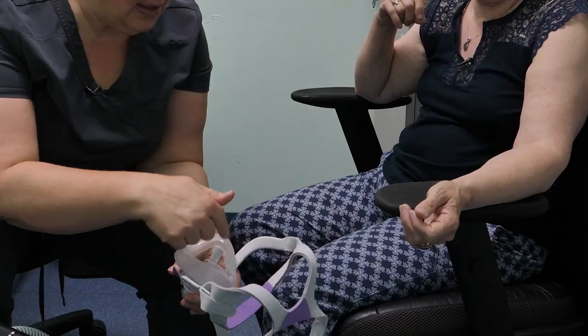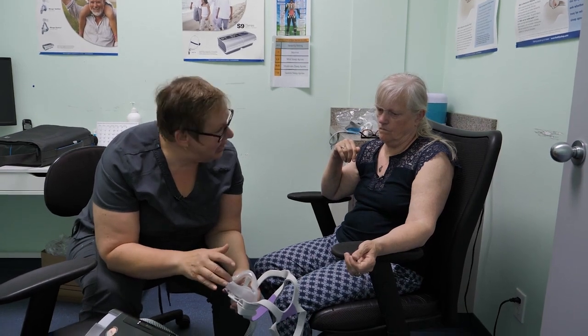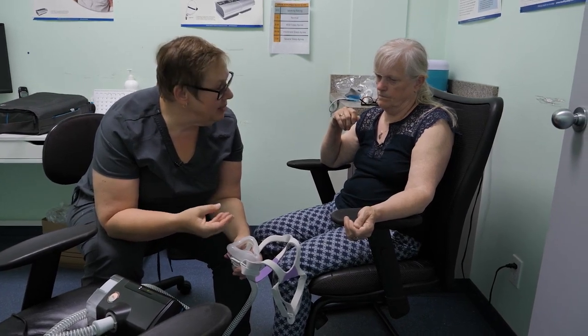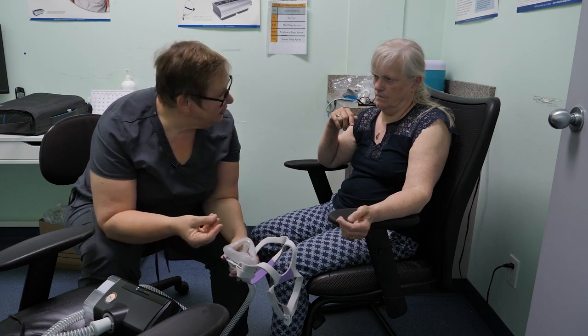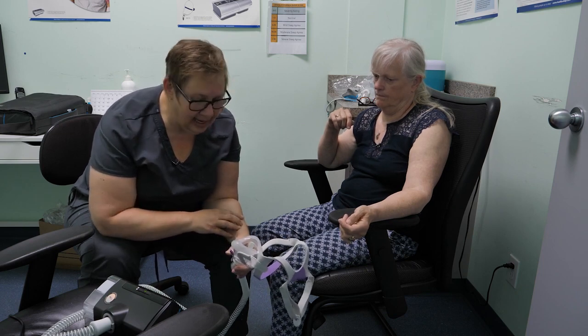Each day when you wear a mask, I need you to wipe down the cushion of the mask, and that way you're getting rid of the oils from your skin so they're not staying on the mask, because those oils can cause the mask to deteriorate over time. So just take a soft cloth. Some people use baby wipes. We also have CPAP wipes here, or just a soft cloth with a little mild detergent on it, and wipe it down, and then just make sure it's nice and clean.